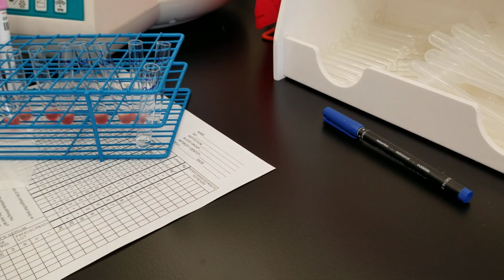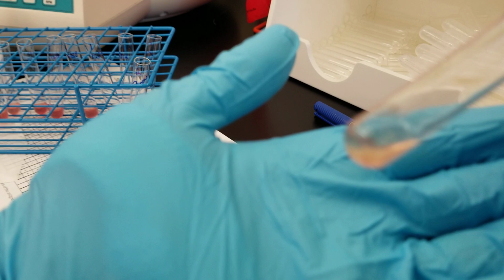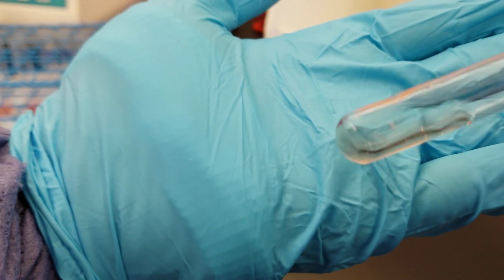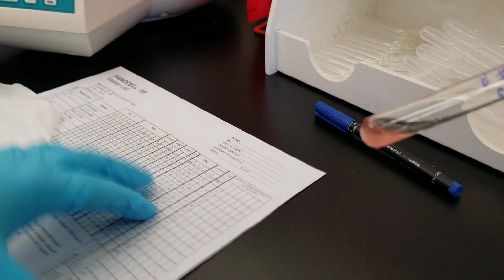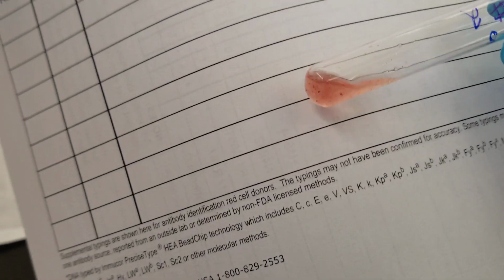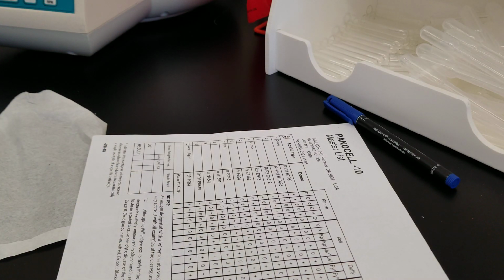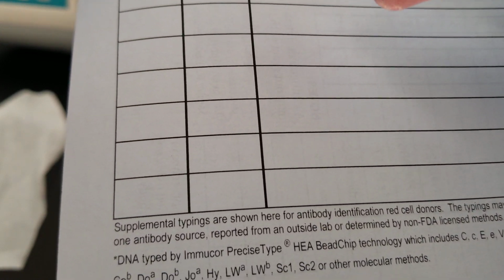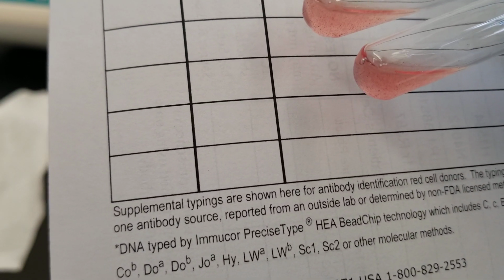Tripod trouble. Okay. So let's see. The first one we had. That's good. Well, it looked like a solid 4, but it's breaking apart. So this is visit number 2, and it looks like it's coming apart. Okay, so we'd probably say that a 2 or a 1. That was straight. And this is 2 and 4. 1 and 2, 1 and 4. So this is probably about, looks like a 1 in both of them.